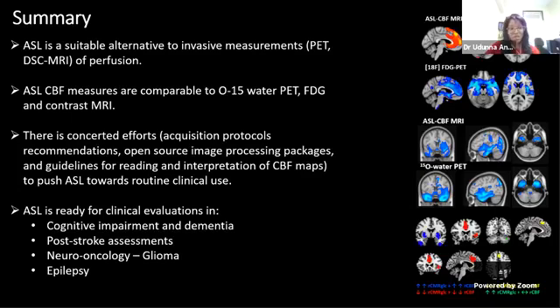And epilepsy is very interesting because in epilepsy, there are some patients that don't actually respond well to drugs and do require surgery. And in those patients, it's really ideal to find where that seizure focus is, so we can accurately remove the lesion that's causing the seizure and minimize the seizure frequency. The problem is that in some cases, the brain appears normal. So when we do the workup for epilepsy surgical planning, we acquire anatomical MRI images, and in about 30% of the time, the brain appears normal.